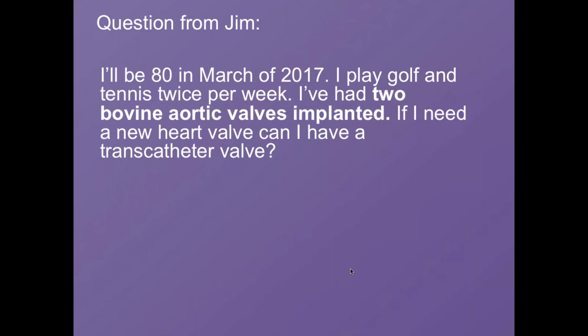Adam, this is a great question. I'll take this. This is Chris Malacery. Congratulations on playing golf at the age of 80. We certainly hope that your new bovine aortic valve will last you for the rest of your life. The question is whether or not we can do something about it if you happen to outlive that valve. I think for this particular case, if the valve fails over time, this would be a great case to do an aortic valve-in-valve procedure. So aortic valve-in-valve procedure is a transcatheter procedure, TAVR procedure.